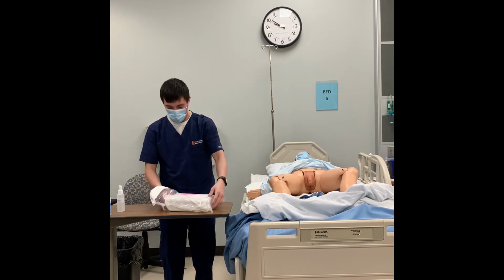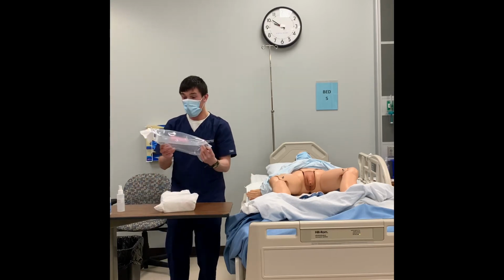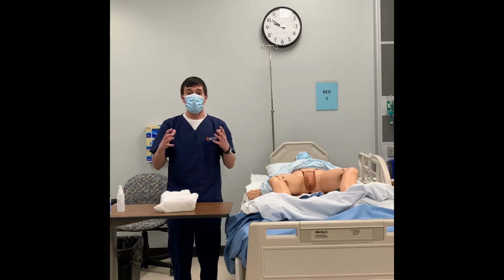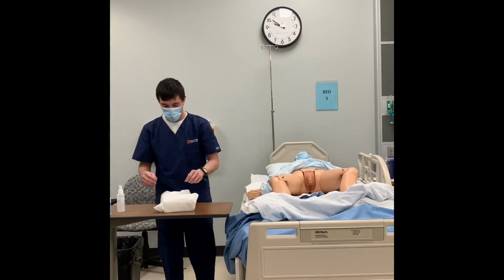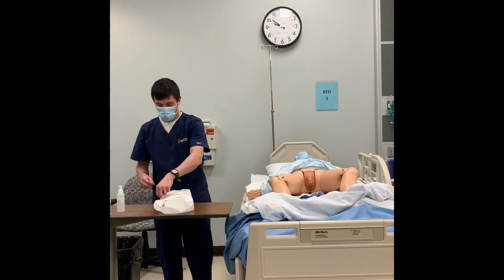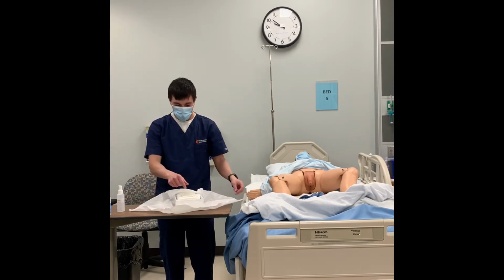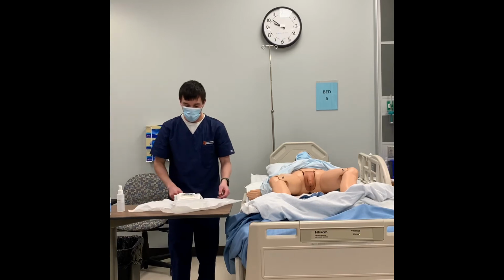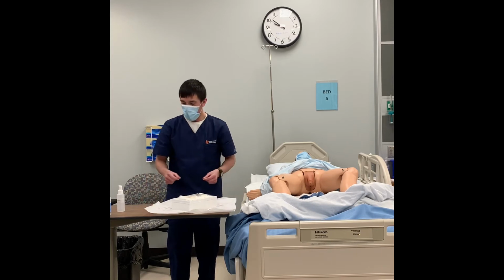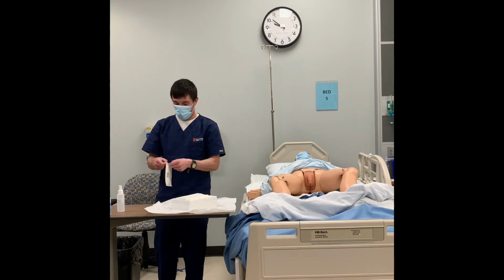And then I am going to take out the kit, and making sure now that I'm getting into the catheter, that I never dip my hands below, okay? So I'm going to open up just with that 1-inch border away from me. Now the other ones will go out to the side, and then lastly, opening up to me. Again, just that 1-inch border, and then I'm going to turn this just a little, and then get my gloves and start donning my sterile gloves.